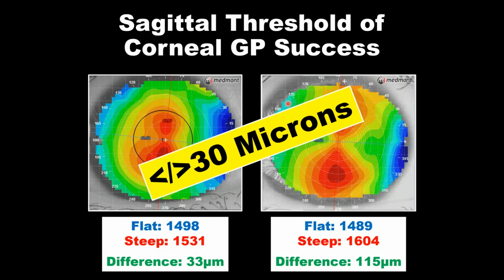And of course, it's much more important in Ortho K that we have an ideal landing all the way around, because we rely on that contact lens fitting in the closed eye environment with whatever lid force is at work. We need that lens to be well centered. Whereas in a corneal GP and in normal conventional wear with lid interaction, a superior central GP fit is probably going to be acceptable if the optic zone is big enough, but way more sensitive in Ortho K. So 30 microns or greater, I would use a toric landing lens.